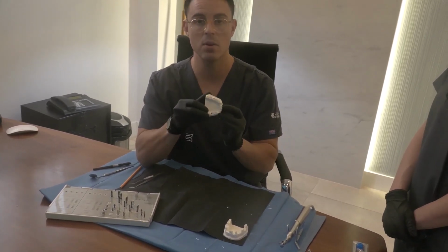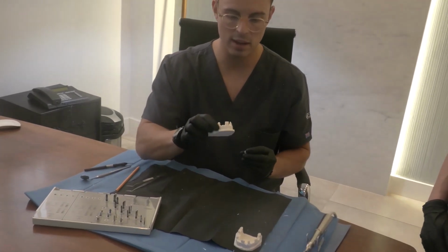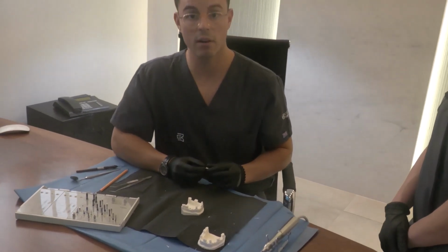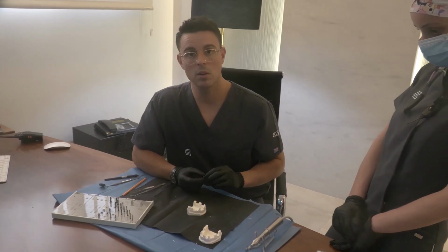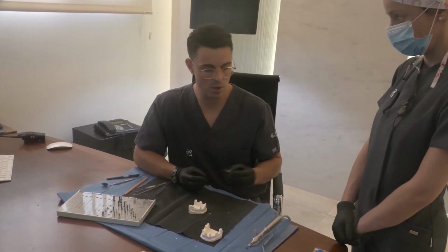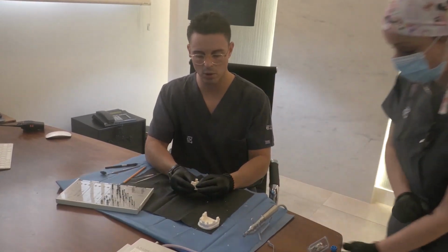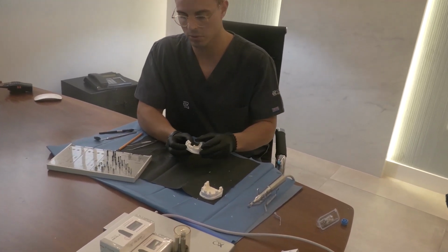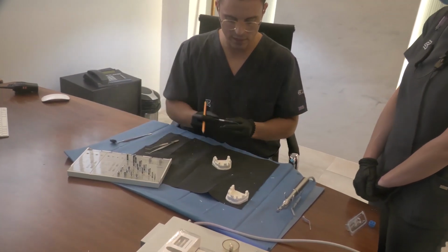in the apicocoronal perspective. Okay, and now we're going to make the same sequence for the anterior area, so you can capture the tips and pearls for implant placement in the aesthetic area, where the emergence profile is even more critical, considering that it's not only about preventing biological complications, but also aesthetic disorders. So again, we'll follow the same principles.